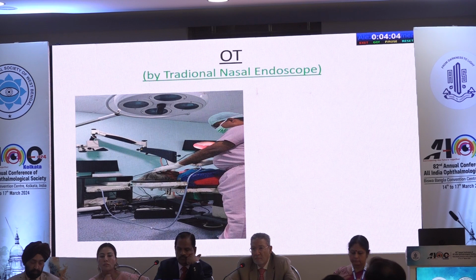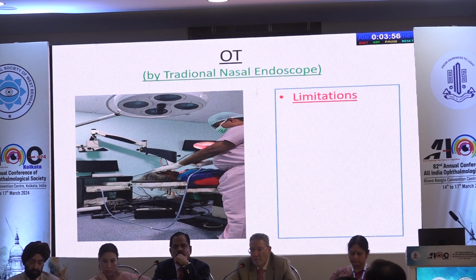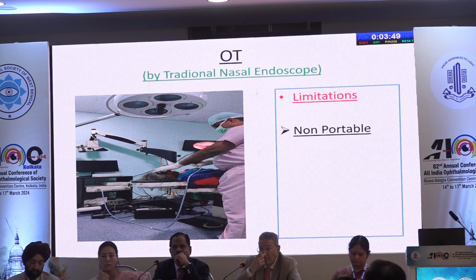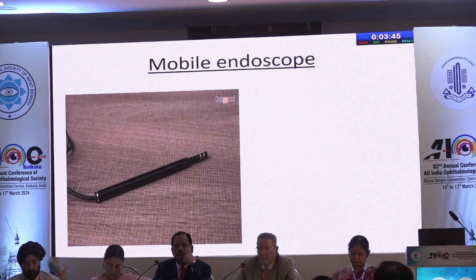If we are not able to do it in the OPD, then we take the patient to the OT and do the traditional nasal endoscopy. But here is also a limitation. This system is non-portable. The LED system and endoscope can't be carried anywhere. And another thing is that it is expensive compared to our mobile endoscope.